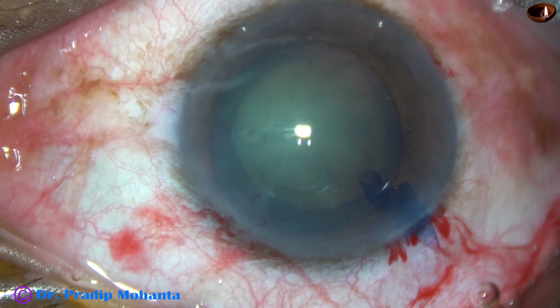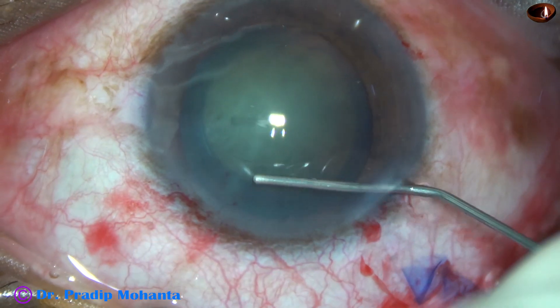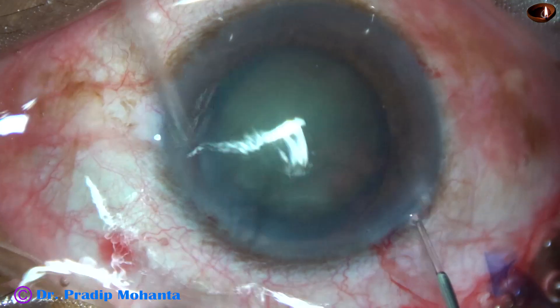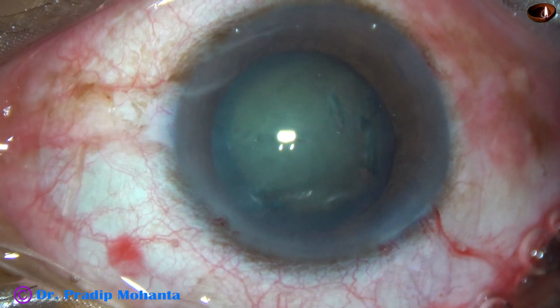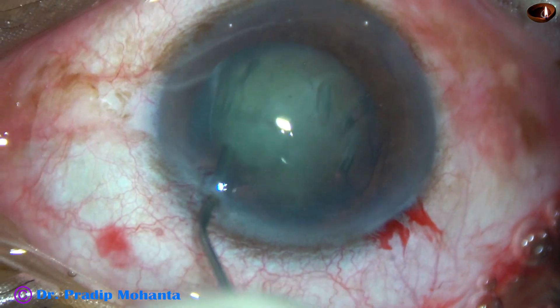And now hydrodissection with BSS and a 27-gauge cannula. It is done at multiple points and the nucleus rotates nicely.